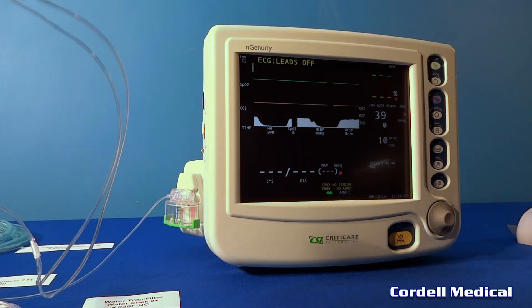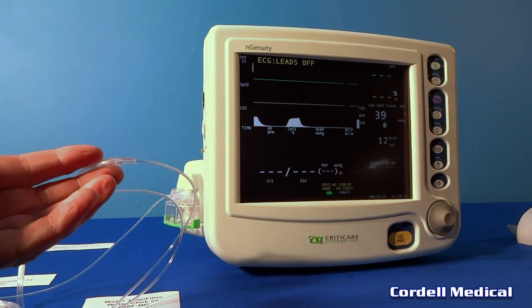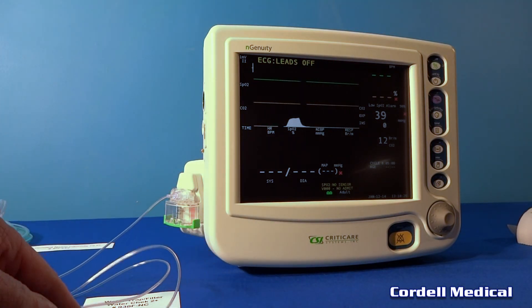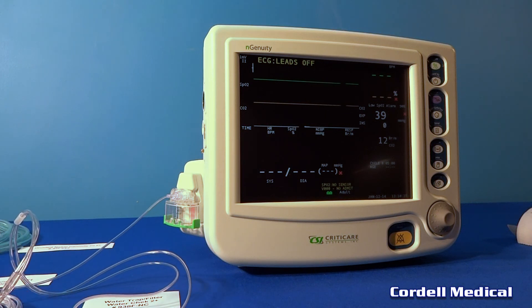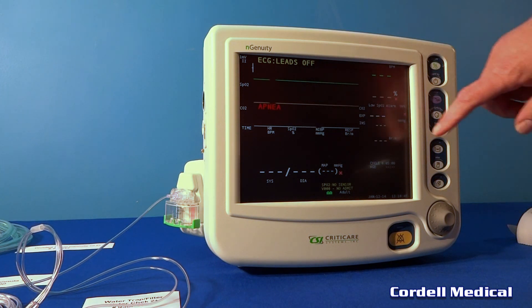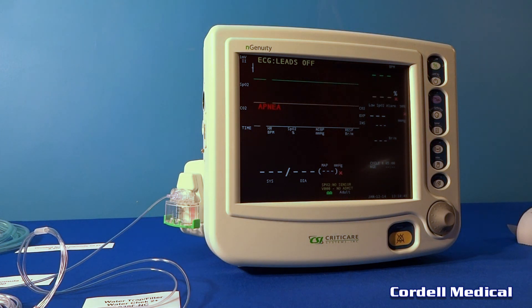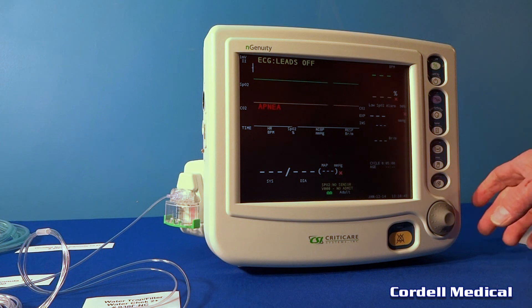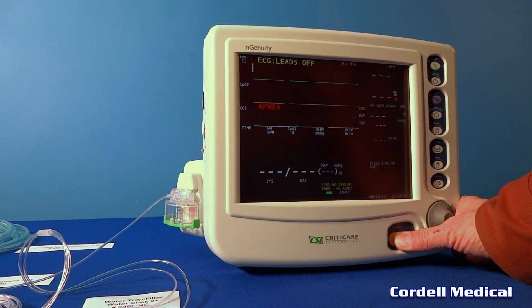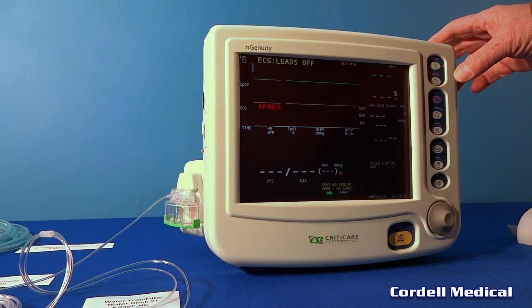I will now take that nasal cannula off. We have this thing set to go to an apnea alarm in about 30 seconds. There goes the alarm. We'll go ahead and shut the alarm — the alarm is off. Thank you very much for watching.